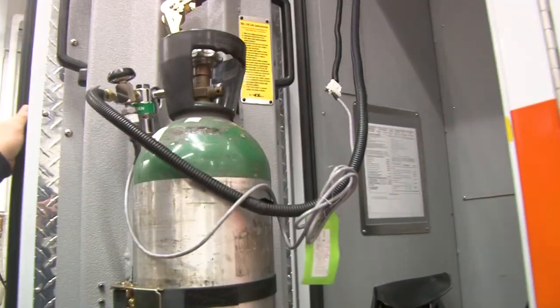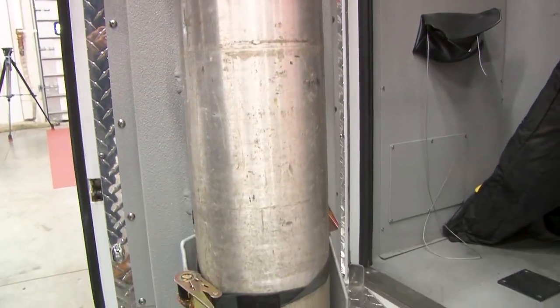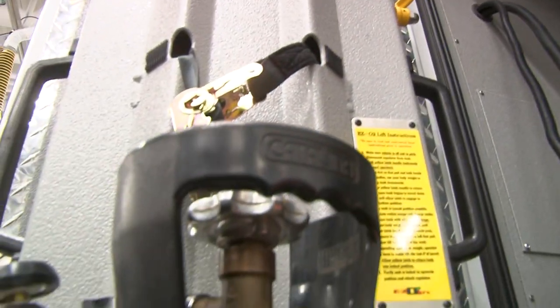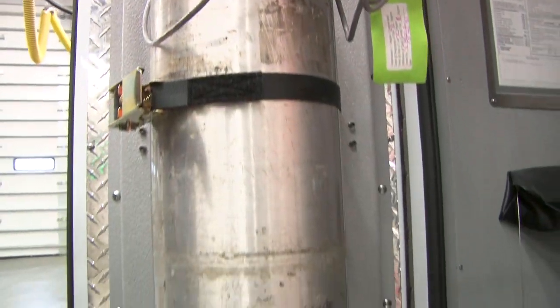So the outside of the ambulance has several compartments that contain all our emergency equipment. So we'll walk you through the first compartment here. So this is a typical, what we call it, the oxygen compartment. It's behind the driver's side. It contains what we call an M tank. It's just a very big tank with lots of oxygen. And it also has some extrication equipment inside that we can use to get people out of the house.